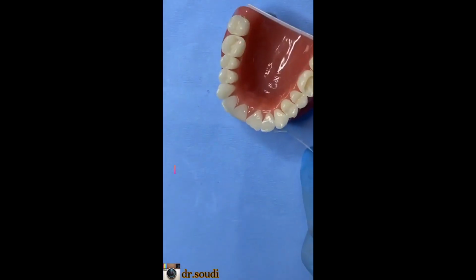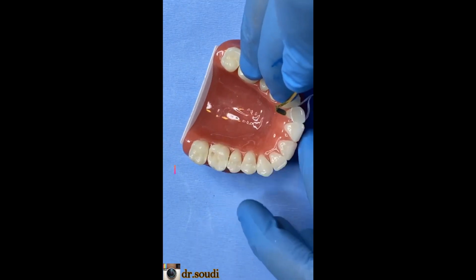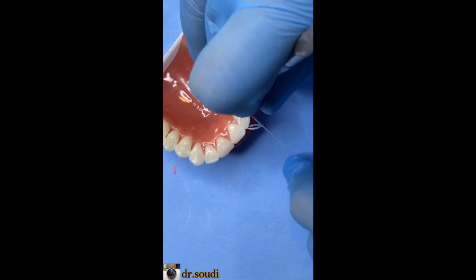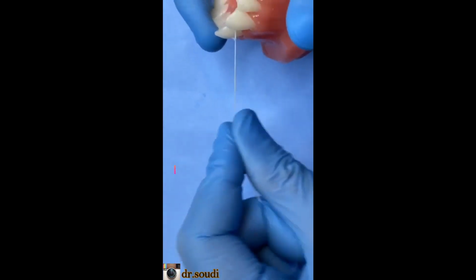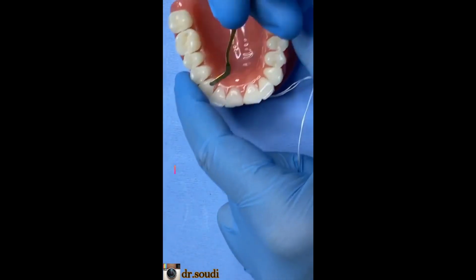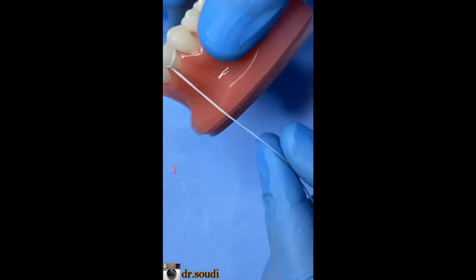This is the end of the gingiva here in the cast, so the floss is not going down. So you can use composite spatula or a blunt instrument to press the floss downward, and then you should close the floss. It's not closing. Take the floss down here, from down to take the most retraction part. Press it downward like this. This is a cast, so normally it goes down in patient mouth, but you know the trick.